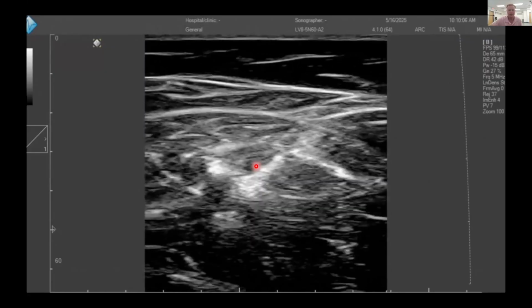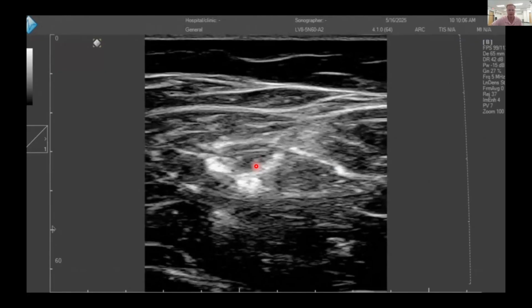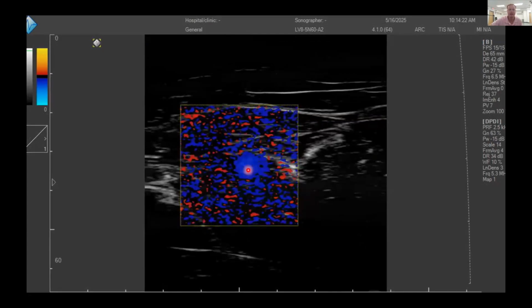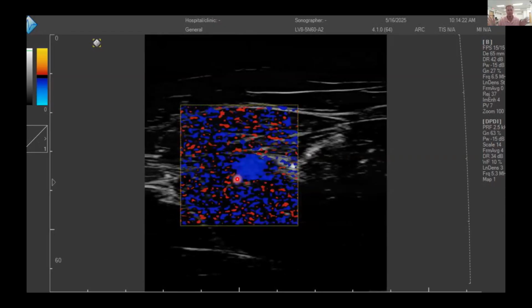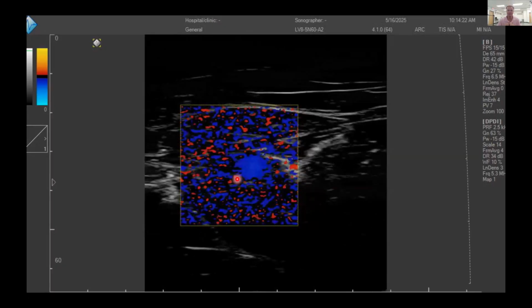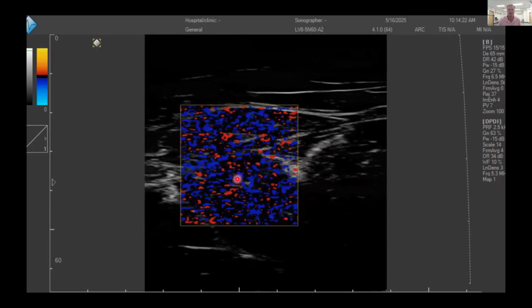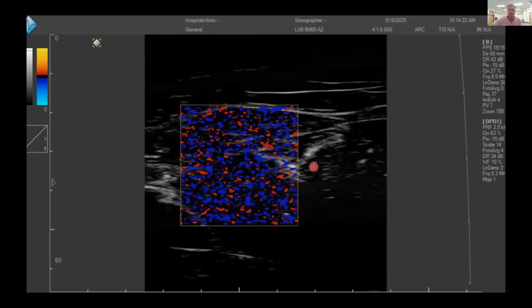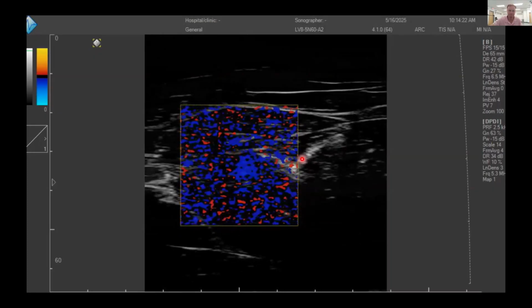But just to give you an idea of what this should look like, not that this is really the main focus of this presentation, we could then confirm using Doppler ultrasound that there is this pulsing happening next to the nerve. Again, unfortunately, you might not be able to see this perfectly because the video is a little bit glitchy, but you should see this blue pulsing almost next to this nerve structure, which is in white here.